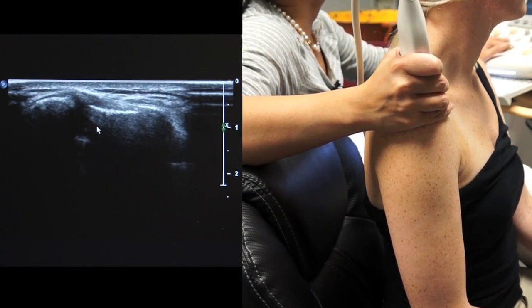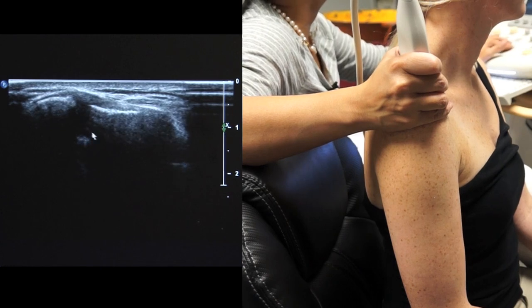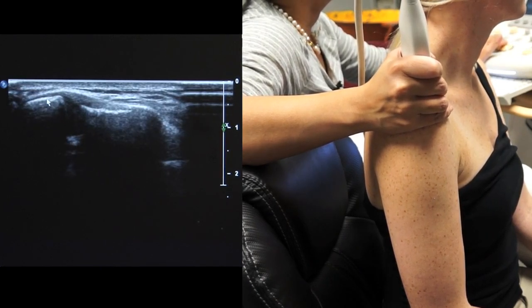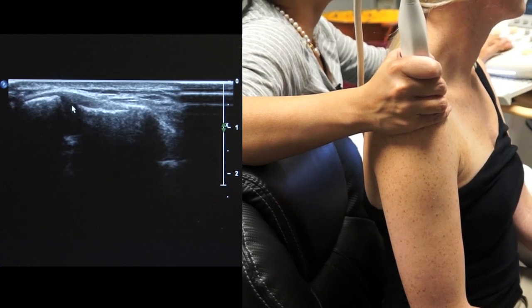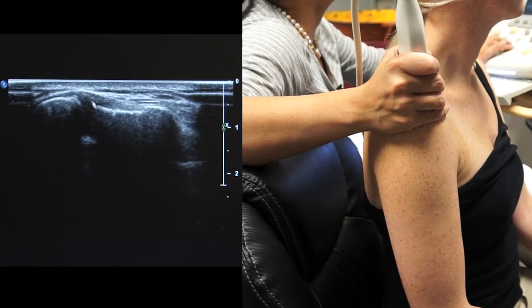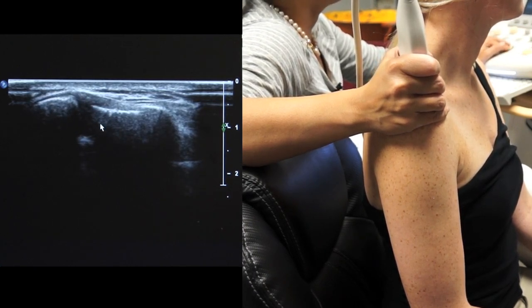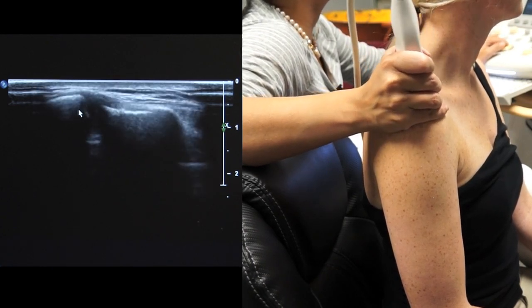And one thing I want to point out is, so here's the clavicle, here's the acromioclavicular joint and the acromion, and it is normal for the cortical margin of the clavicle to be higher or more superior than that of the acromion. And then we have the capsule or the ligamentous union here between the clavicle and the acromion. Okay, and that's where we look at the acromioclavicular joint.